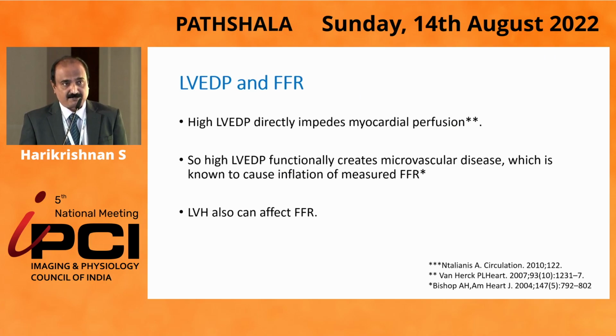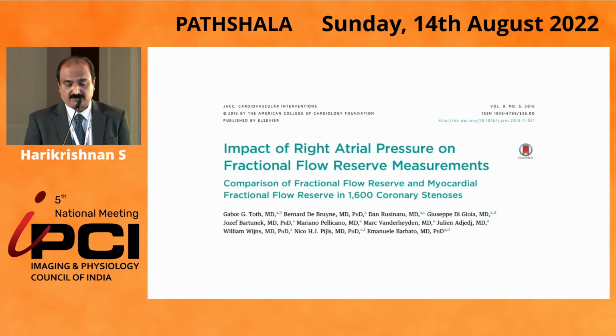LVEDP can affect FFR. High LVEDP, because we know LVEDP impedes the myocardial perfusion. So high LVEDP functionally creates microvascular disease, which is known to cause inflation of the measured FFR. LVH, gross LVH, can also affect FFR.